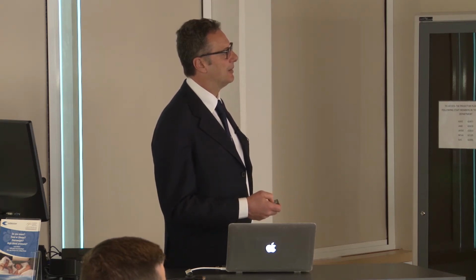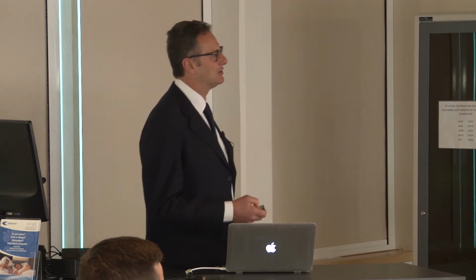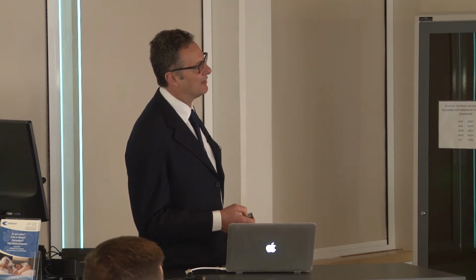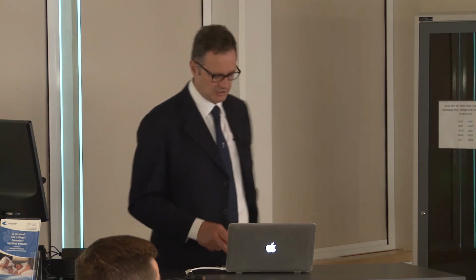And of course, probably with NBI, this is a very old picture. Probably nowadays with NBI you can appreciate some atypical vascular pattern inside the lesion or in the surrounding tissue.